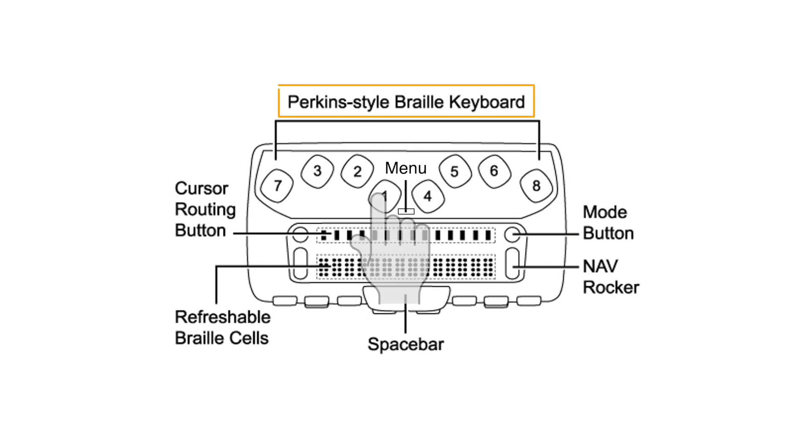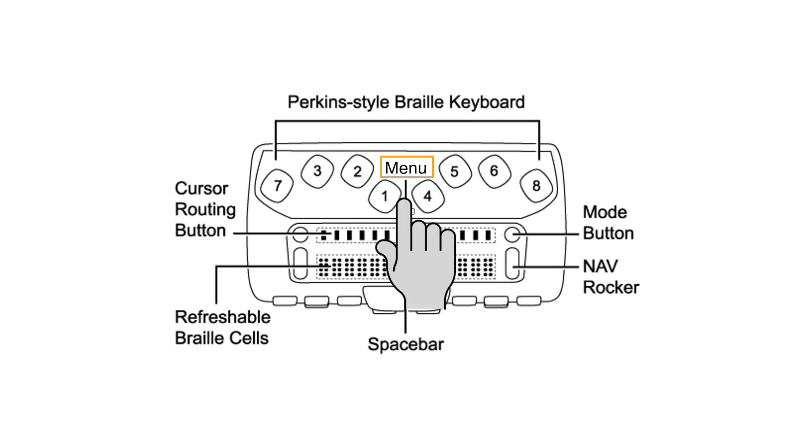At either end of the Braille line is a nav rocker. Above each nav rocker is a nav mode button. Positioned directly behind the cursor router buttons is the Perkins style Braille keyboard. The small horizontally elliptical button located between dot keys 1 and 4 is the menu button. The menu button is used to access the Focus configuration menu as well as display focus status information during an active USB or Bluetooth connection, specifically with the Focus 40 Blue itself.